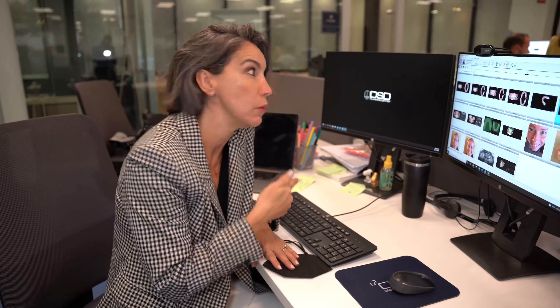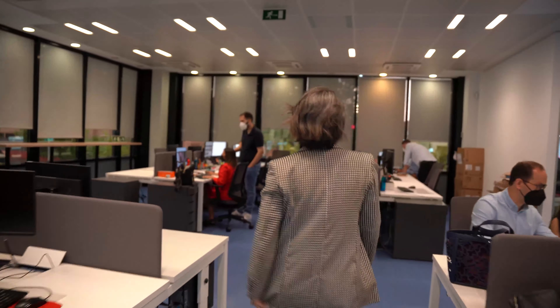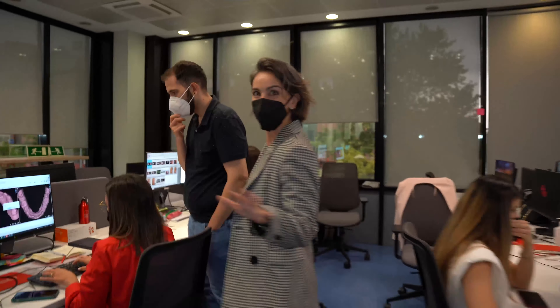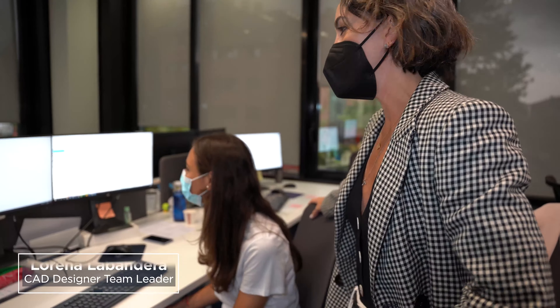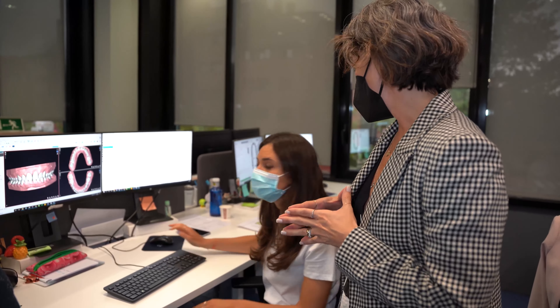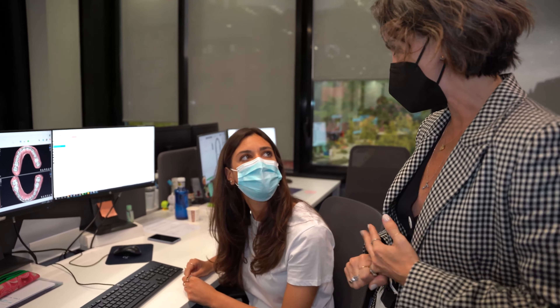I have the smile frame ready. I will talk to Lorena now to explain my ideas about this case. We are preparing two options and I will explain to Lorena what she will be performing on both options. Here we have the informal meeting of the interdisciplinary team. We are planning two options for this case: one option is orthognathic surgery, and the other option is more conservative with ortho plus crown procedure. You can work on both options and then I'll check the case with you.